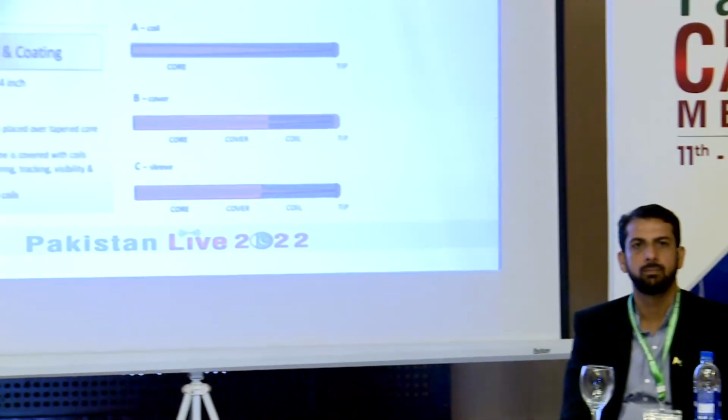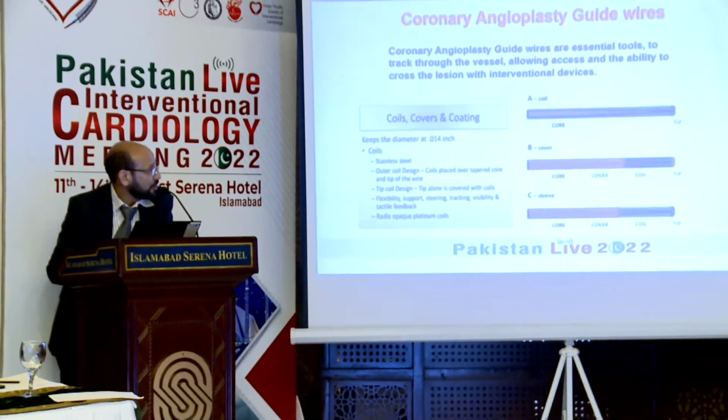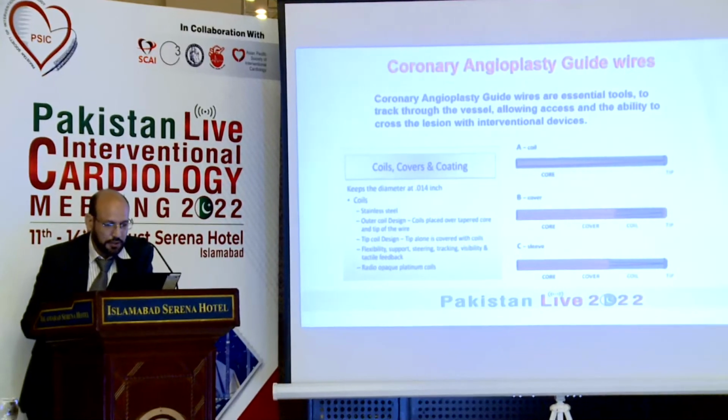So, coronary angioplasty guide wires. The coronary angioplasty guide wire is an essential tool to track the vessel, allowing access and the ability to cross the lesion with interventional devices. The structure of an angioplasty guide wire: you see it has a coil, cover, and coating.